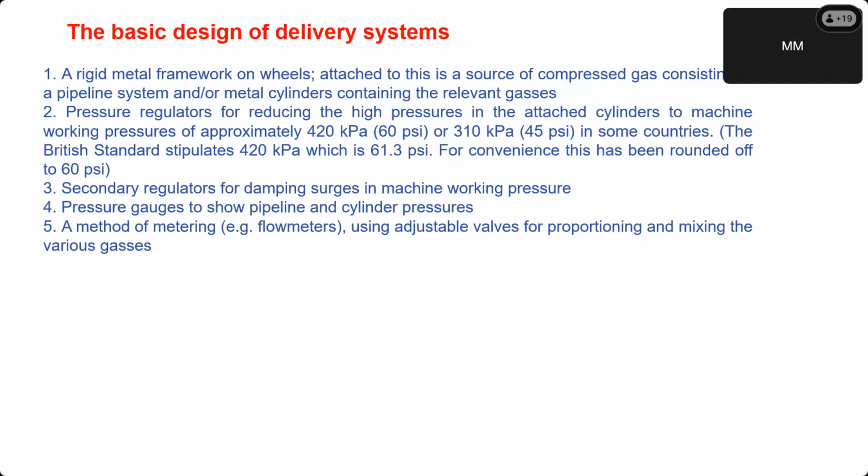Earlier machines had a flow meter for carbon dioxide. Why were they using carbon dioxide in the anesthesia machine? To stimulate respiration. Excellent. So they thought hypercarbia will stimulate the patient because they were using only ether, and patients were quite deep and had almost respiratory depression. So they thought by giving additional carbon dioxide, they could stimulate the respiratory center and make the patient's spontaneous respiration revert back to normal. That was the idea.